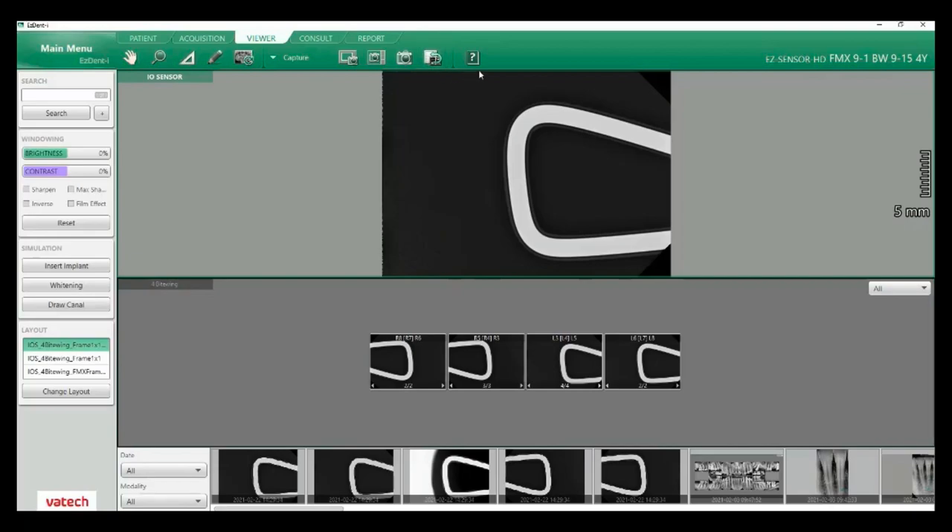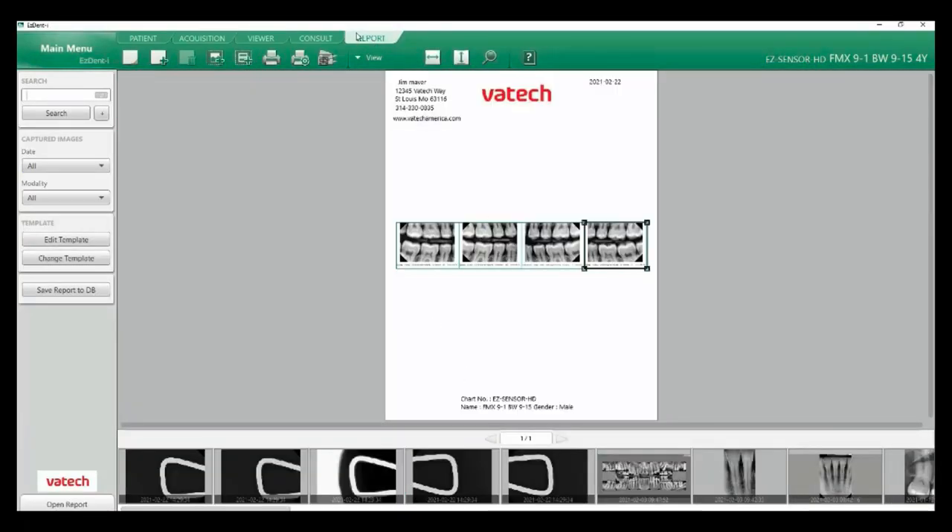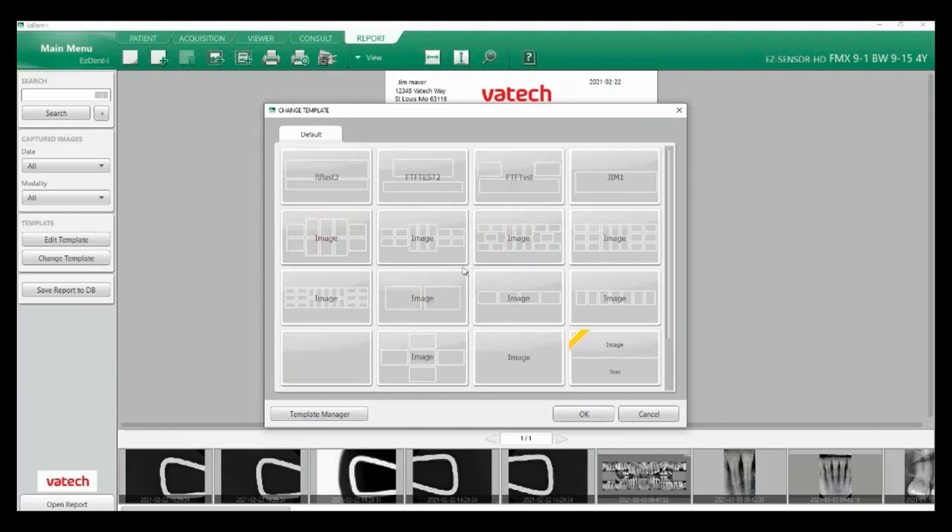Now that we've looked at our viewing tab, let's go over to our last tab — the reports tab. Under the report tab you have different layouts: create a new report, add a page, add your image box, printing options, settings, DICOM print, and then your drop-downs for export via email or export to your desktop. We do have various templates — if I go to change template, I can scroll through available templates using the wheel on my mouse.